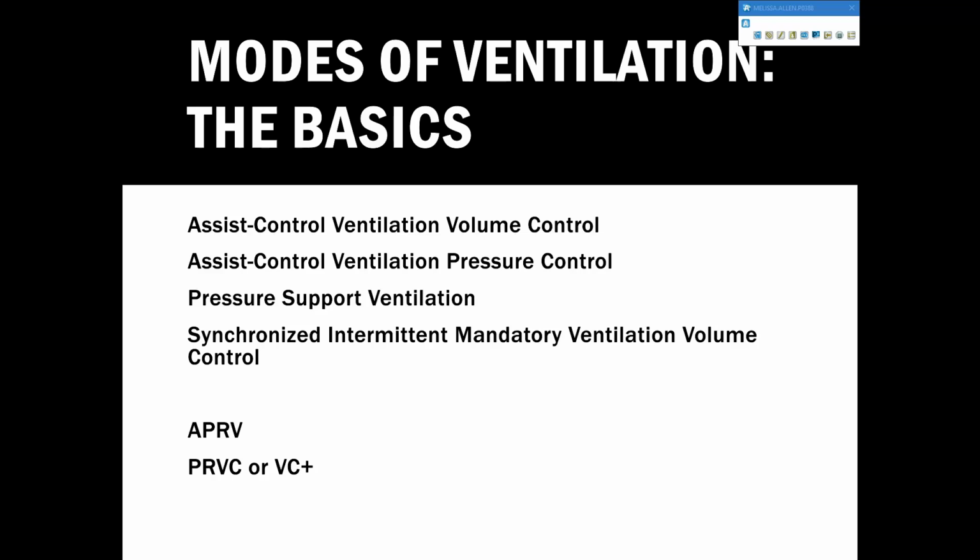So with PRVC, it's going to give you that magical waveform of pressure control and allow you to choose your volume, but it's going to deliver it like a pressure breath. What does that mean? Deliver it like a pressure breath. Well, have you ever noticed if you take a patient on volume control and these volumes are out of control, which should be your indication that they need to switch into pressure control, and the peak pressures are out of control, sorry, not the volumes.